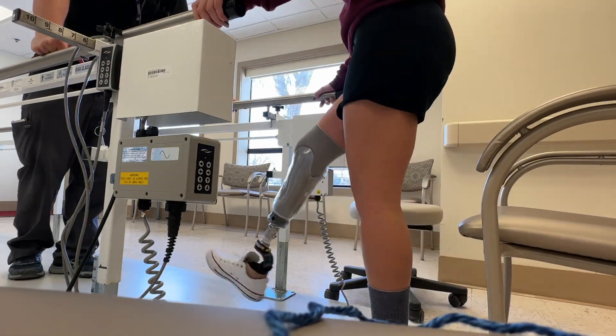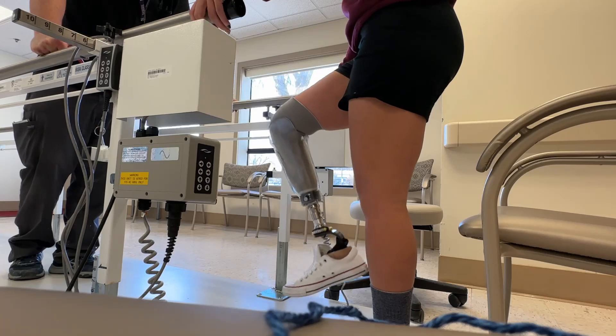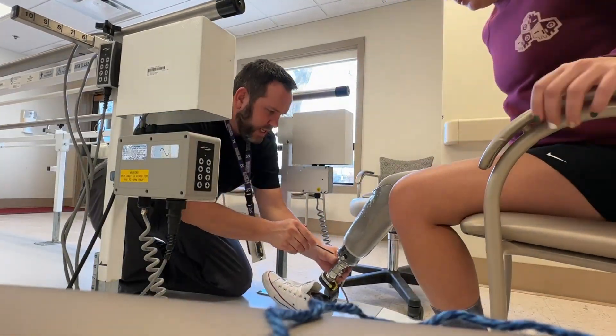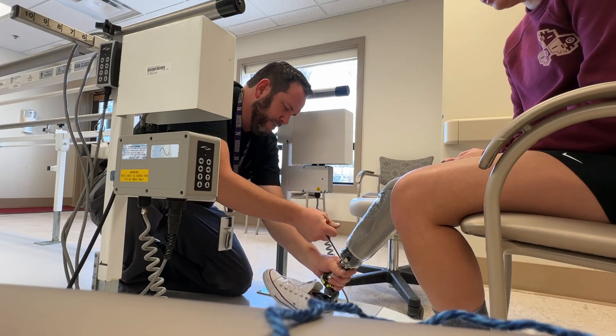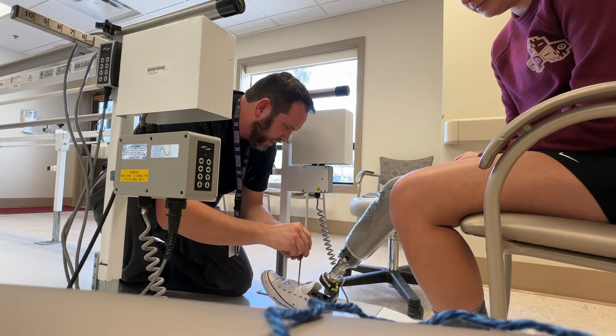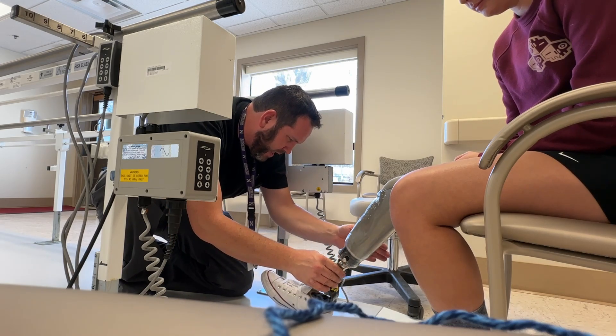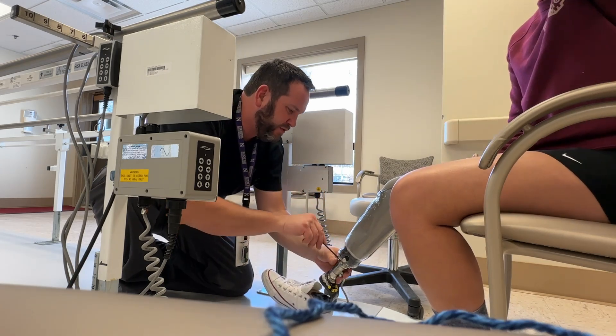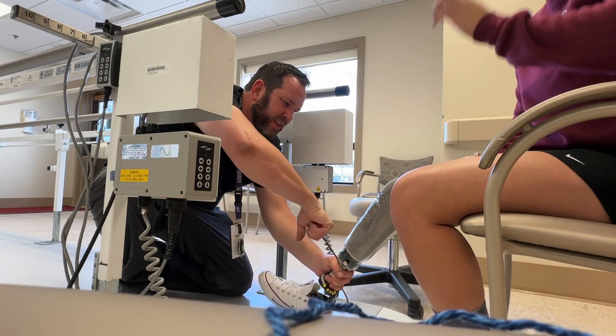When you stand and you wobble, does it normally stay pretty tight on you? Yeah. Okay, so we're going to have to address that. First things first, and then we've got to check your heights. I've got a couple things I've got to do before you go. None of these are Loctite. It works great for test fitting, but you can't leave here without them Loctited and torqued.